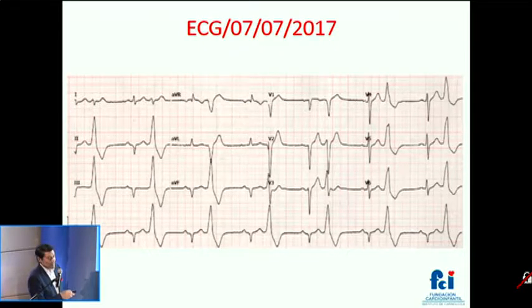Of course, in general terms, the easiest conclusion is that if there is a lower axis, as we can see in this extrasystole morphology, obviously we won't waste time mapping the lower wall, the inferior structures, the apex, etc. Here, this is pointing to a high structure, which obviously represents the outflow tracts. So this is an exercise we will continue throughout the case presentation. But keep in mind at least 3 differential diagnoses where you are going to place your catheters for mapping and where you are going to focus your efforts to save time.